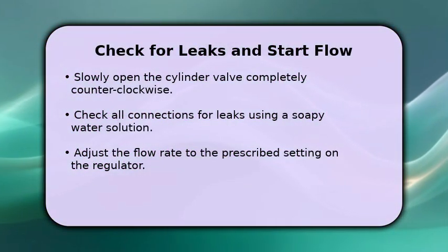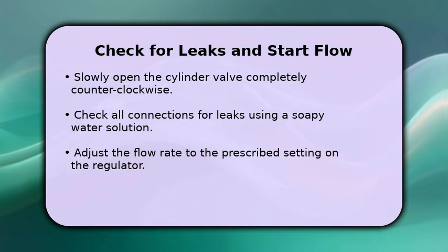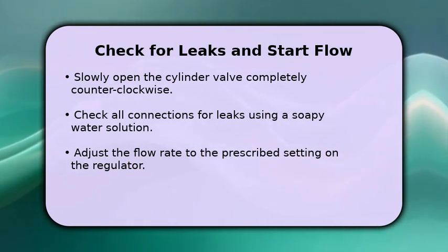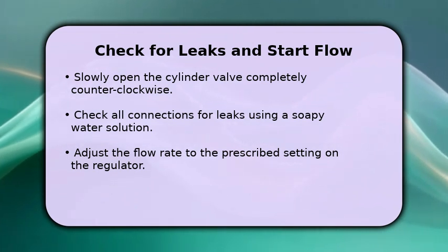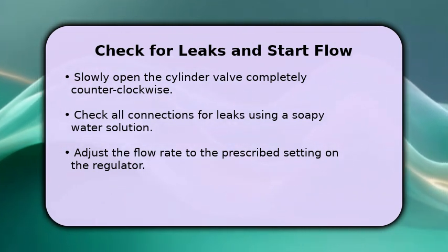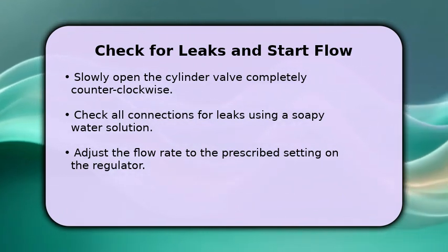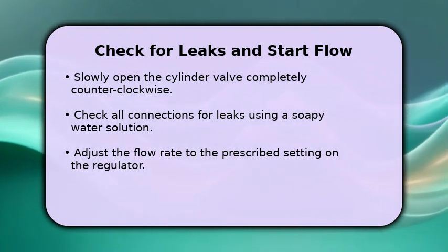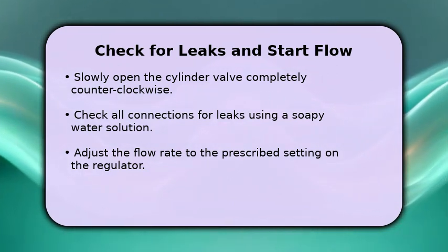With the regulator attached, slowly open the cylinder valve all the way counterclockwise. Now, check for leaks. Apply a soapy water solution to all connections. Look for bubbles, which indicate a leak. If no bubbles appear, you're good to go. Finally, adjust the flow rate to the prescribed setting using the regulator's control knob. Always ensure the oxygen is flowing correctly before use.